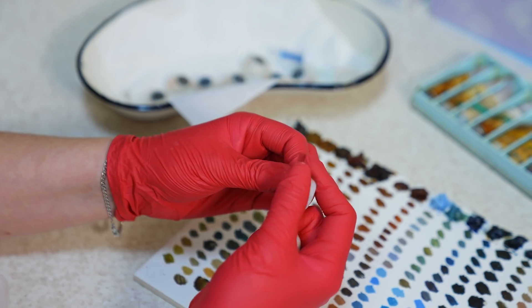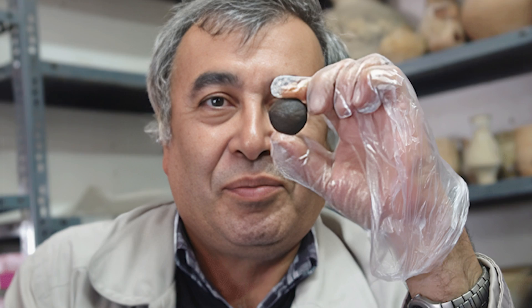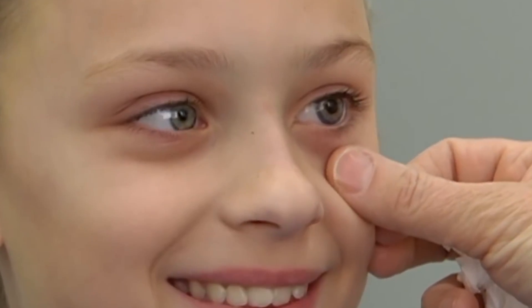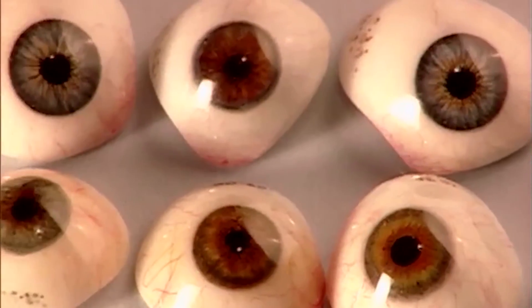Artificial eyes have played a vital role in restoring confidence and appearance for individuals who have lost an eye due to various reasons, dating back to ancient civilizations. Over time, the methods of crafting artificial eyes have evolved significantly, combining ancient techniques with modern technology to create lifelike prostheses.